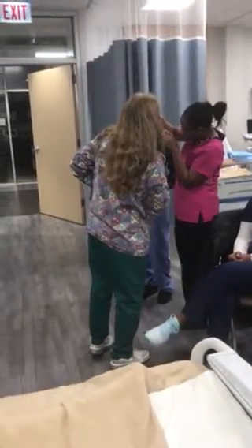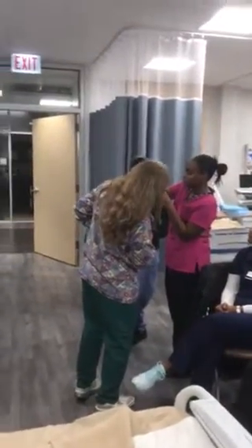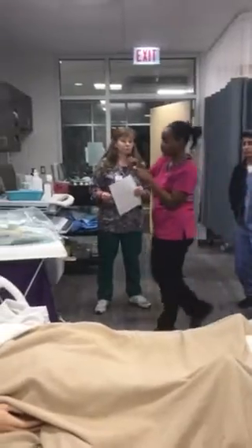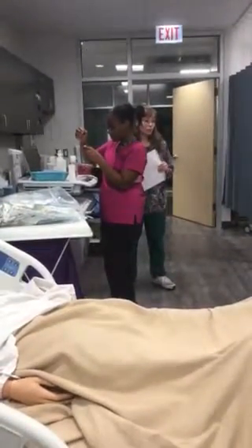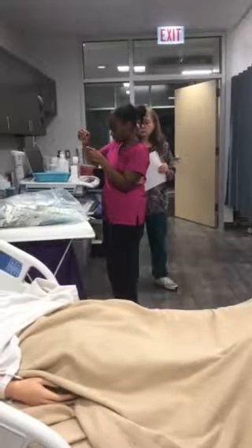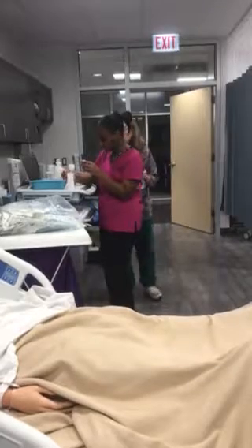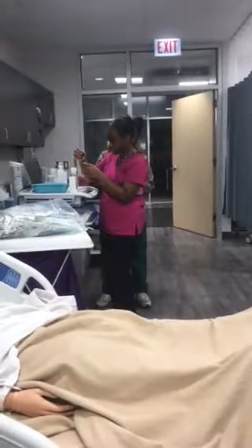So what would you do? Well, I would draw up 2 of them. Yep. So go ahead and put it in that cup. So you want to draw it up again? Yep. Keep in mind, some of them actually have 1 full milliliter in there. So we're going to half, and we're taking out.